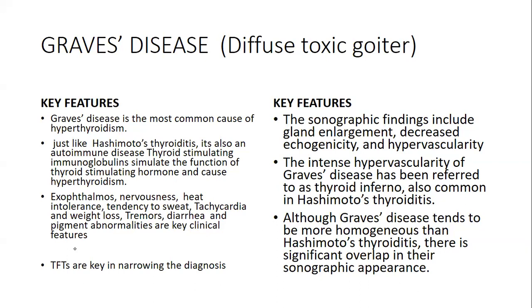Now, what is key in these parenchymal diseases of the thyroid is that to narrow the diagnosis, you need to follow up with TFTs so that you are able to distinguish clearly between Hashimoto's thyroiditis and Graves' disease. You know that Graves' disease is usually associated with hyperthyroidism.